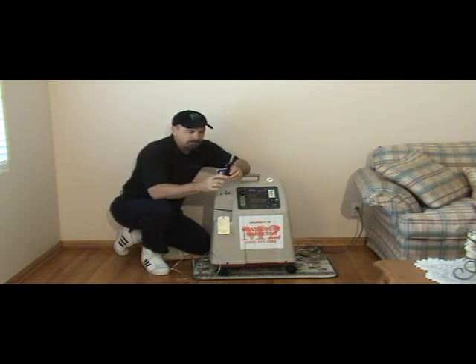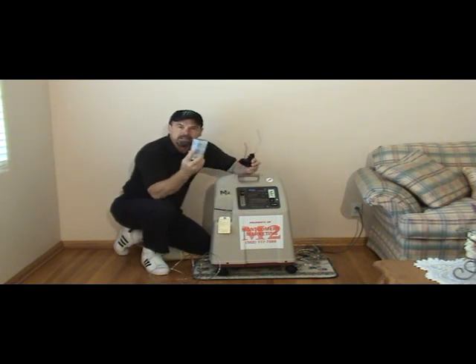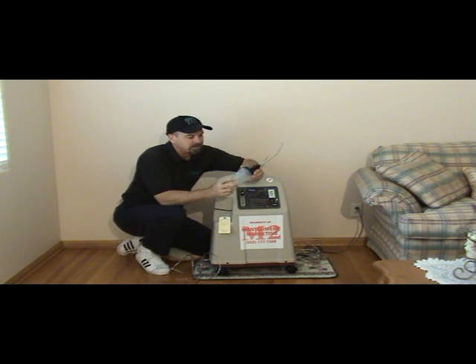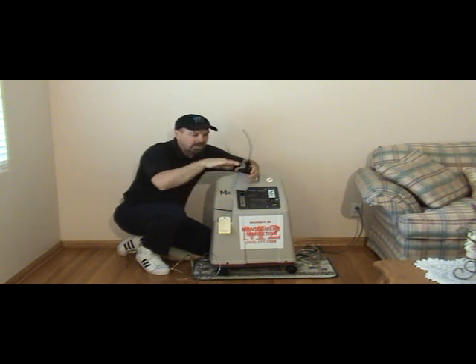Then the humidifier bottle, what you'll do is unscrew the top, and you'll fill it, again not filling past the maximum line. Now this is the biggest problem that we have with concentrators: after they've filled this bottle and they're putting the lid back on, they don't get the lid on square and tight, so there's leakage around here, and then it appears that there's no oxygen going to the patient. So when you're doing this, make sure that after you filled it, you get this lid back on square and tight, and look at it and make sure that it is even around there, that it's not sitting sort of cockeyed, okay?